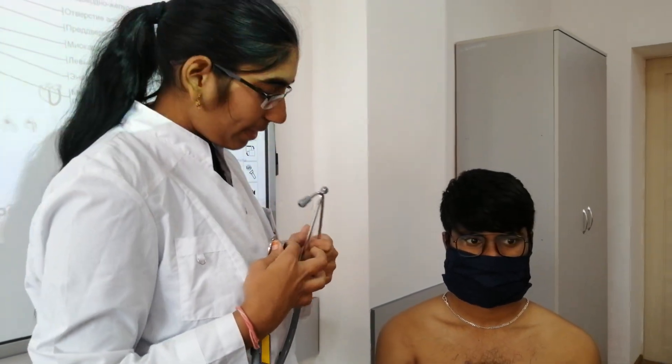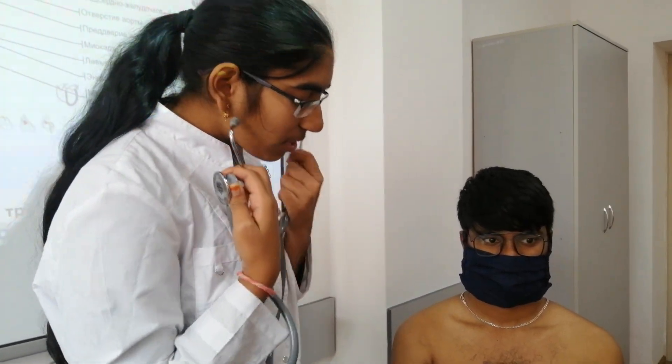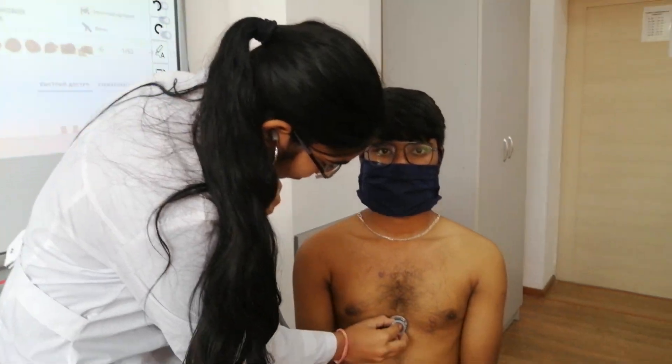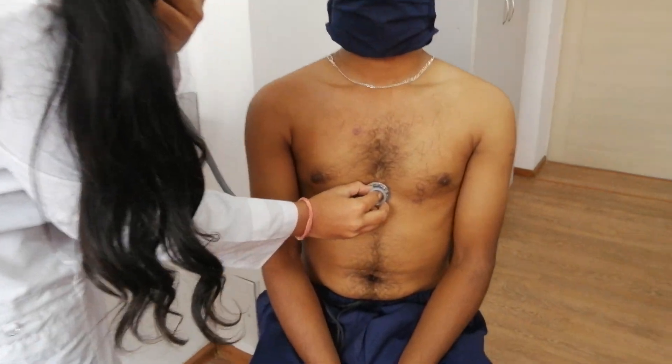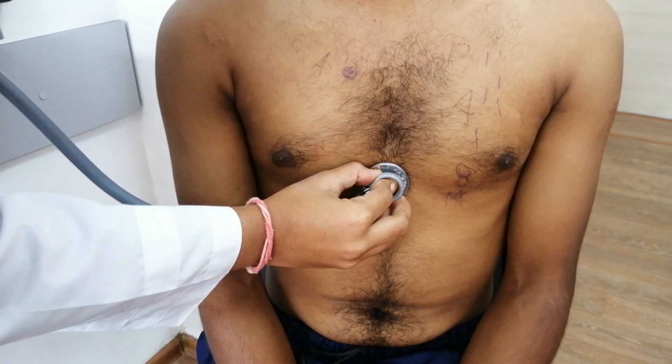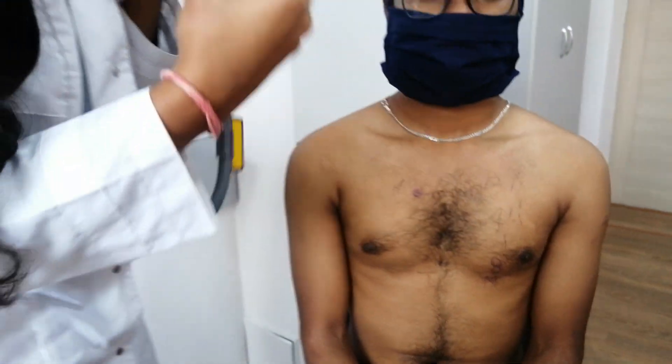Are you listening to the sound? Are you listening or only placing the stethoscope? Next point name: Xiphoid process. Tricuspid valve, located at the xiphoid process of the sternum. Are you listening to the sound? Yes.